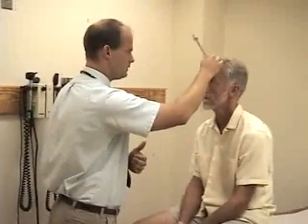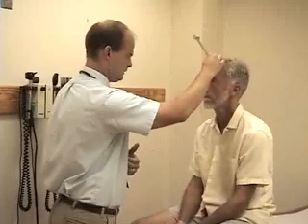Okay. If you need to test hearing, this is an opportunity to do that. Let me have you cover your right ear for me and tell me what it is that I whisper here. 21. Good. Here I have my 256 hertz tuning fork, and I'm first going to do the Weber test and see whether his bone conduction lateralizes to either ear. I'm going to put this right in the middle of your forehead, and can you hear this more in either ear? No. Okay. Equally well.